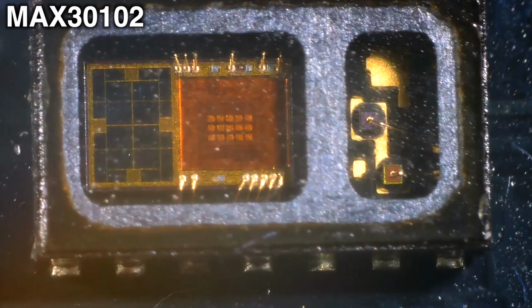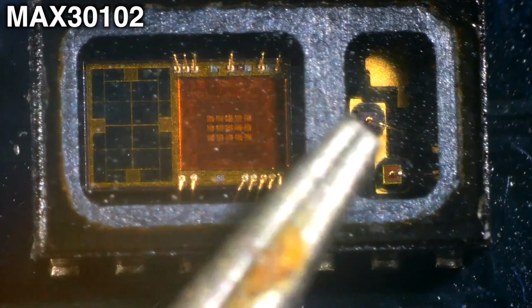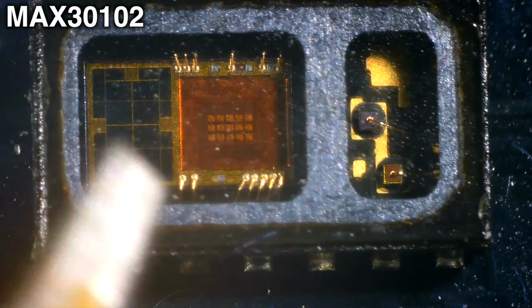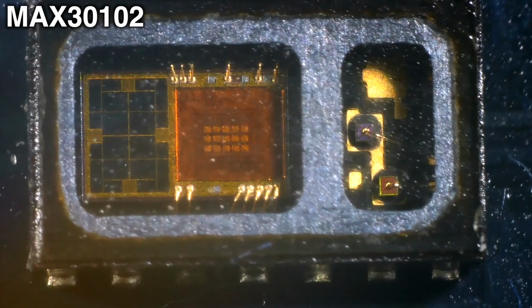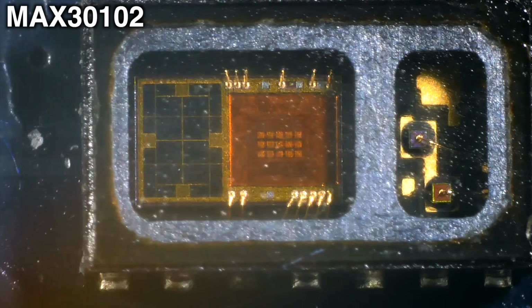So this is really interesting. On this side here, through this window, these are actually two LEDs. So this bottom one is a red LED, and this top one is an infrared LED. And then here we have a sensor and a whole bunch of DSP processing stuff. It's interesting, the actual outputs from this device are just the value of the red and the value of the infrared. Let's power it on.